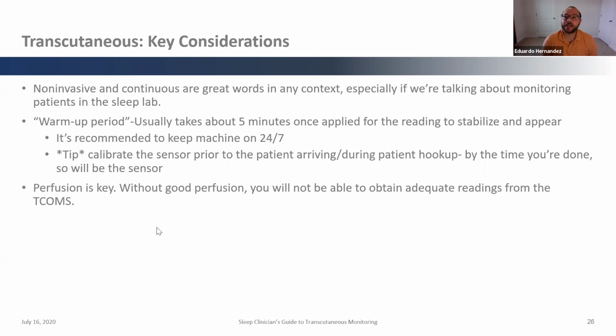You want to set up everything so that way you can minimize your interactions throughout the night with the patient. Because it's a sleep study, if you can set up everything beforehand and they're not swiping at a cannula and they're keeping their pulse ox on and you are getting a CO2 reading, that's a successful night if you ask me as a technologist.